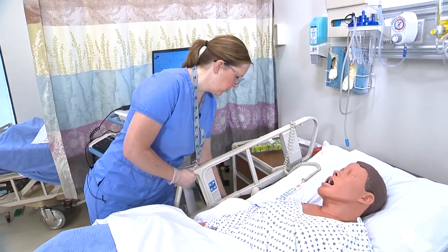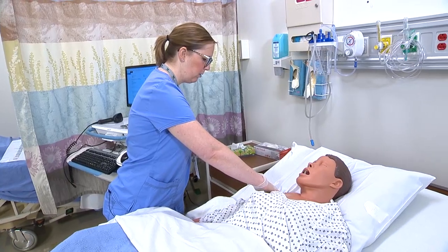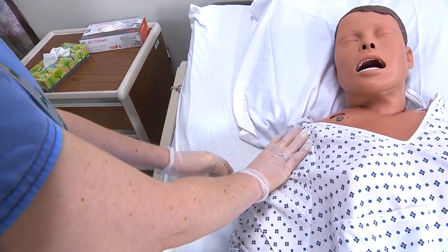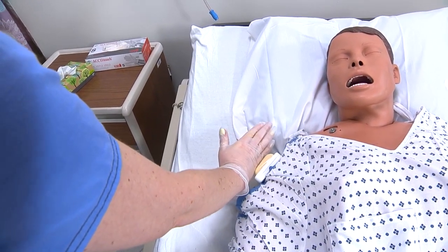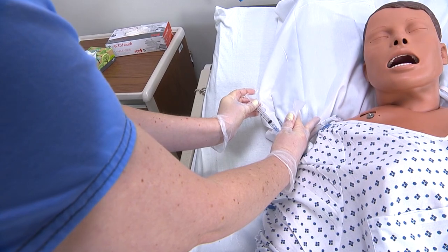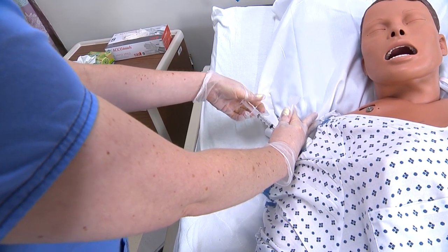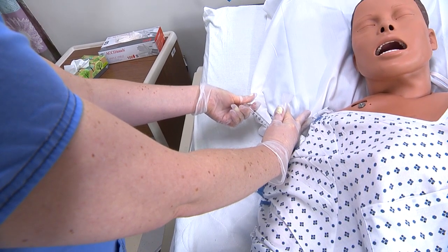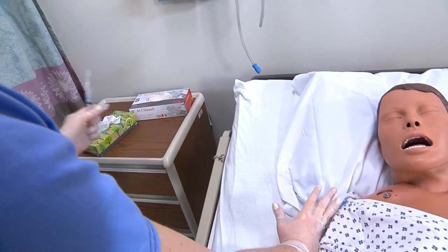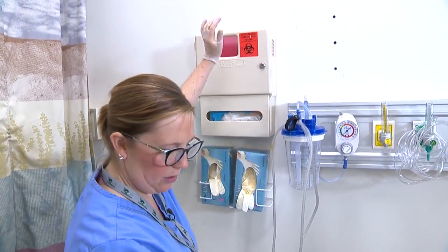All right Morgan, I'm going to give you your injection here. Remember, three finger-widths down from the acromion process. I'm going to clean the area — might be a little cold, Morgan. Now I'm going to Z-track using my left hand. Going to poke at a 90-degree angle — a little poke. Aspirate and make sure we're getting no blood return; if we do have blood we need to stop. I'm good, so I'm going to go ahead and inject, then remove my needle, engage the safety, release my hand, apply a two-by-two, and hold pressure. Then put my needle in the sharps box.